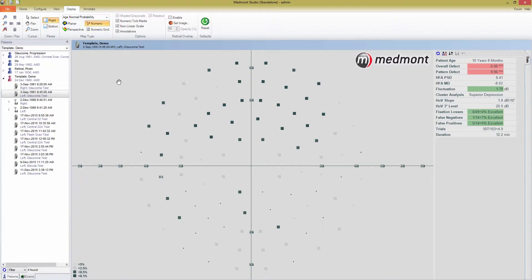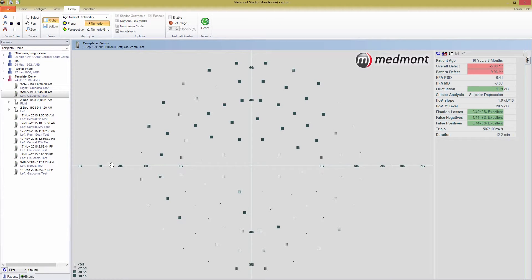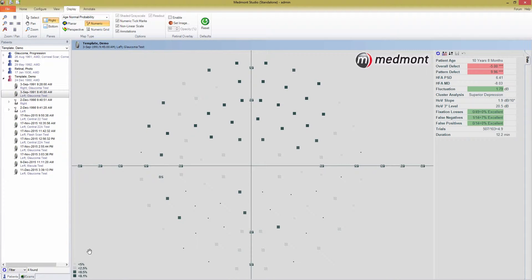With the age normal deviation, unless the point has a huge deviation, it can be difficult to make solid conclusions about the depression. The age normal probability, you can conclusively decide if a point is significantly depressed. At the bottom left of this map, there's a legend, showing how to identify points that have less than a 5% chance of occurring in a normal case, as well as 2.5%, 0.5%, and less than 0.1% chances.